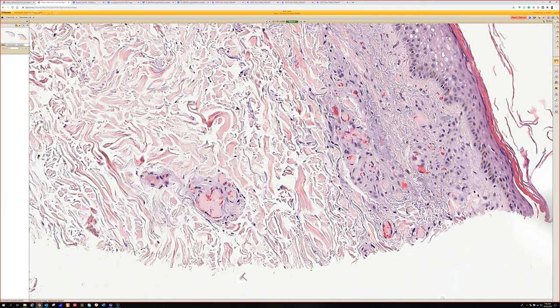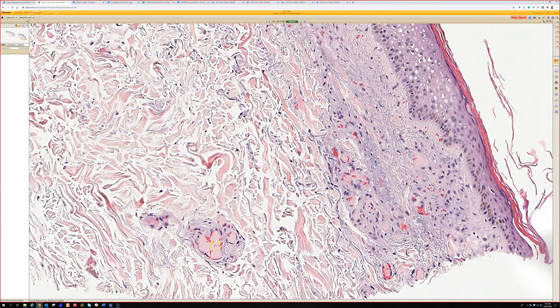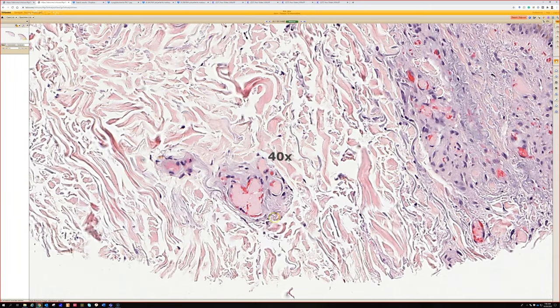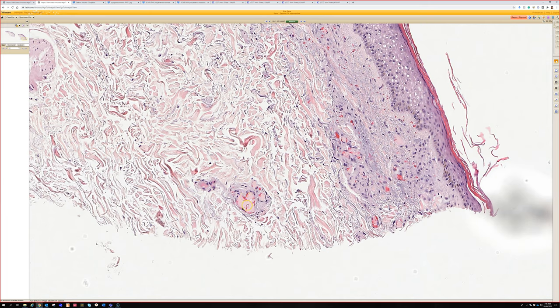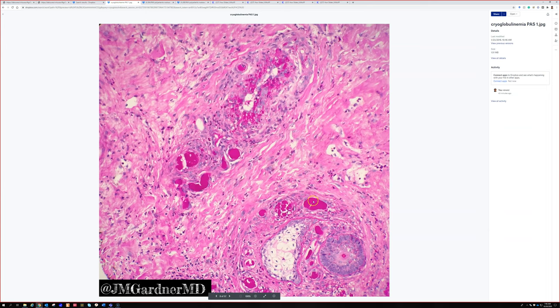Type 1 cryo is monoclonal, usually IgM, and is often associated with myeloma, Waldenström's macroglobulinemia, and other plasma cell or lymphocyte clonal abnormalities. Type 2 and 3 mixed cryo will have these plugs plus vasculitis with neutrophils — those are mixtures usually of IgG and IgM. Here's an example of a PAS stain — this was mixed cryo. You can see some neutrophils and damage to the vessel wall. The cryoglobulin deposits often stain really strongly on PAS.